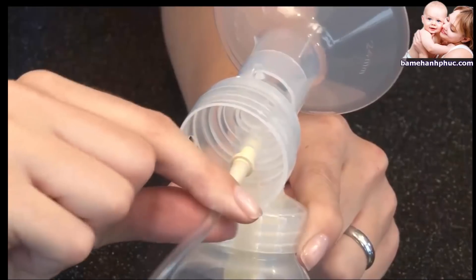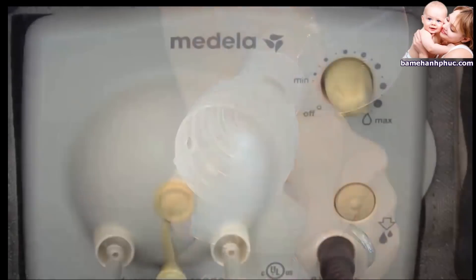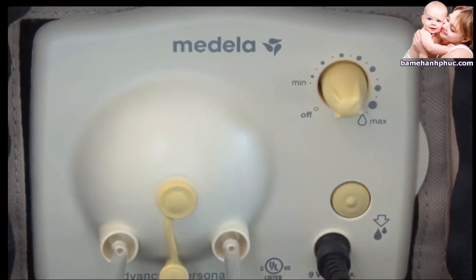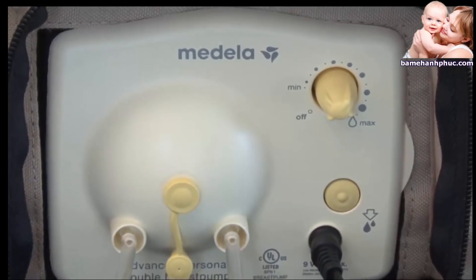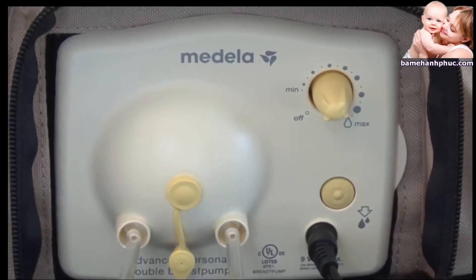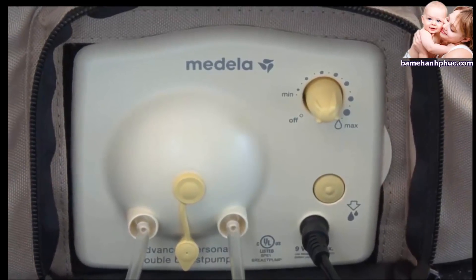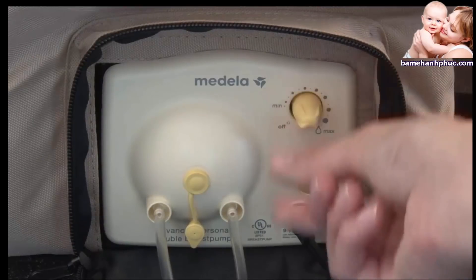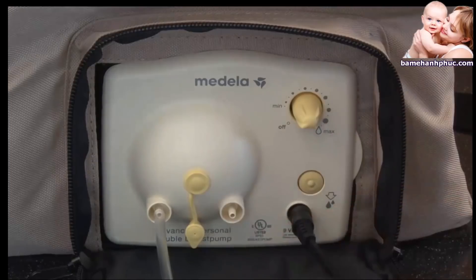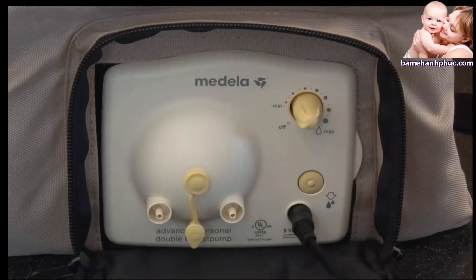Once you are finished pumping, unplug the tubing from the back of the breast shield connector before removing the bottles from the connectors. Let the pump run with only the tubing attached while you store your breast milk — this will allow any condensation that may have formed in the tubing to dry. Then turn off the pump. To remove the tubing, pull it straight out of the tubing ports. Do not wiggle or pull the tubing at an angle.